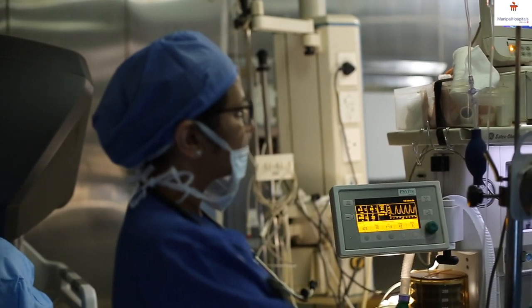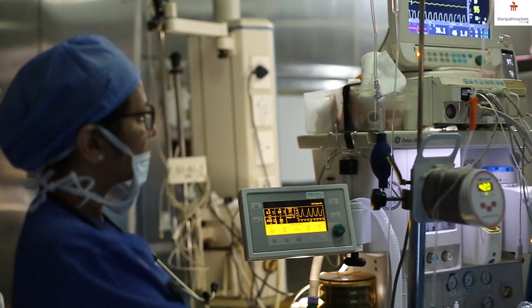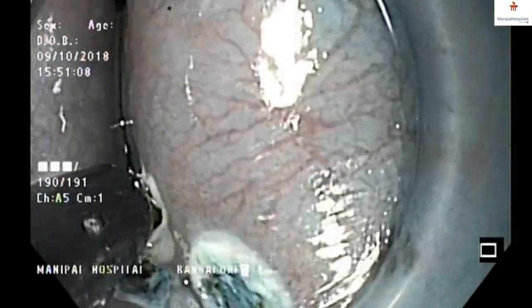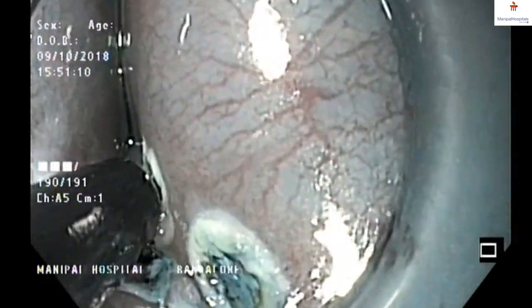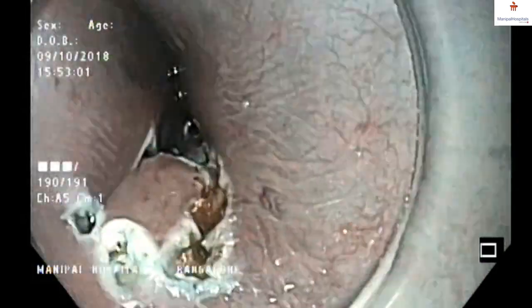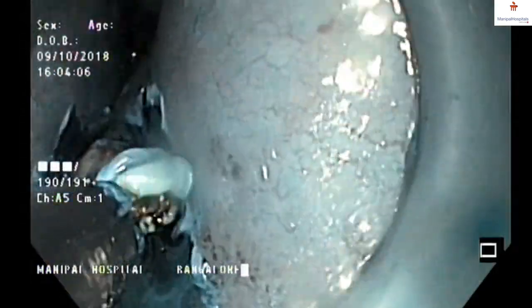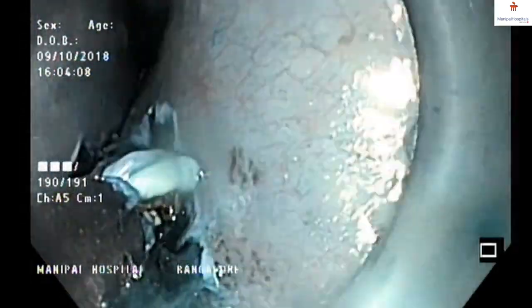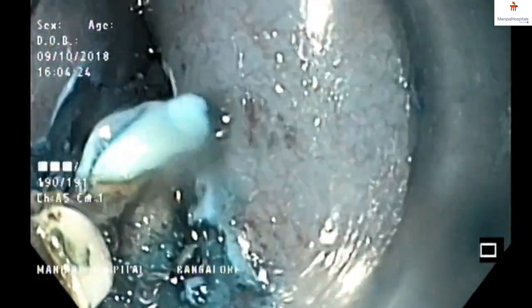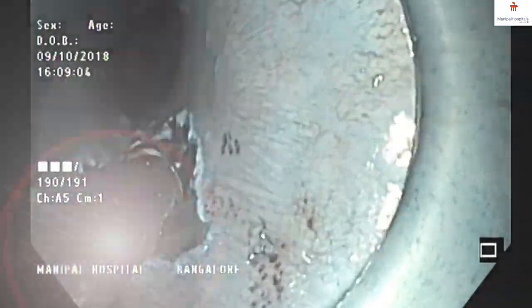I'd like to show the procedure which I performed for a tumor in the esophagus — that is the swallowing passage. You can see I've marked the tumor, then injected and lifted up the tumor, and then dissection of the tumor is performed. The tumor is removed en bloc and the specimen was sent for examination.